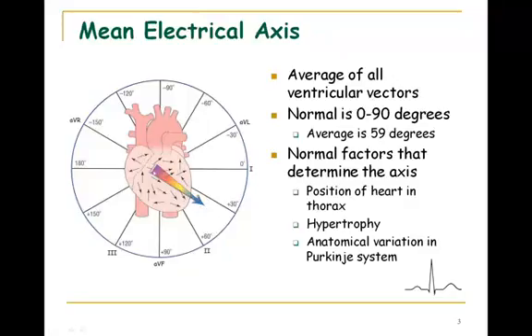I see this big multicolored arrow or vector. The positive end of the vector is giving you an idea of direction. So you know this looks like it's somewhere between 30 and 60 degrees, how it's running. The size of the vector gives you magnitude. What we care about today is the direction. What is the average direction of current flow?